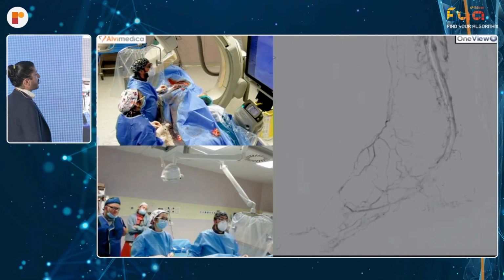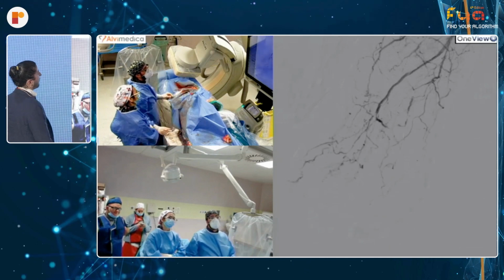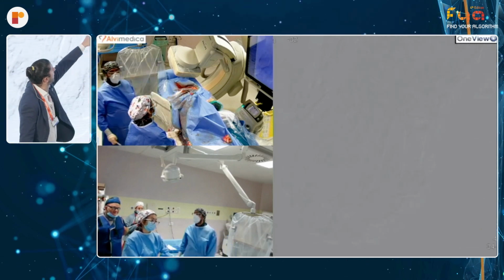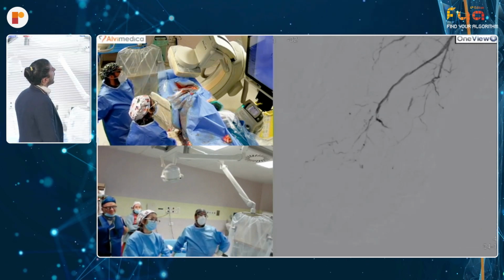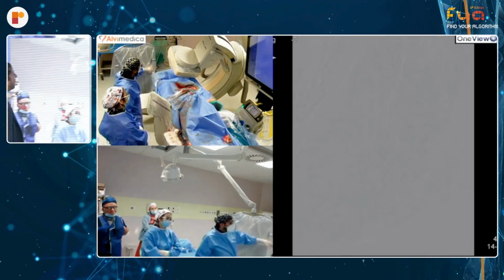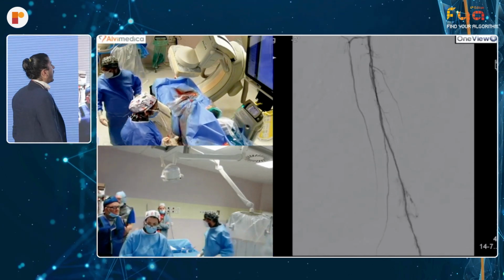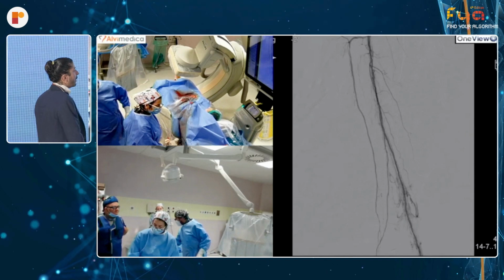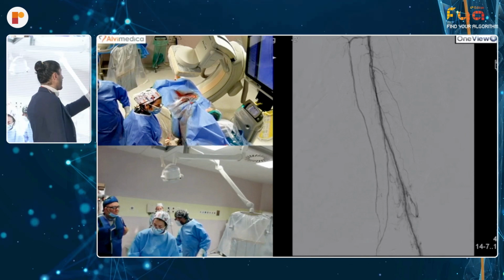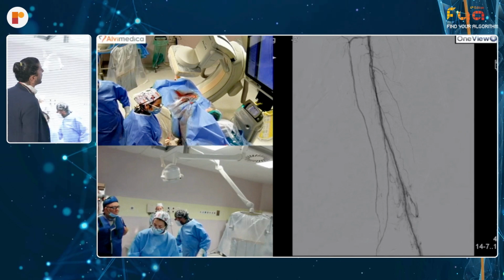And finally, this was our last result, our final check. You can see median plantar functioning, lateral plantar functioning, the bleeding in the first metatarsal artery. I punctured it a couple of times. And residual stenosis in the arch, but a clear improvement of the perfusion for all the foot, as well as acceptable flow in posterior tibial, in peroneal, without any loss of collaterals. Some arteriovenous fistula, I don't think so. This is a connection between the lumen and the vasa vasorum related to the subintimal progression.